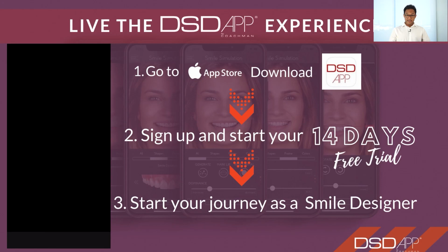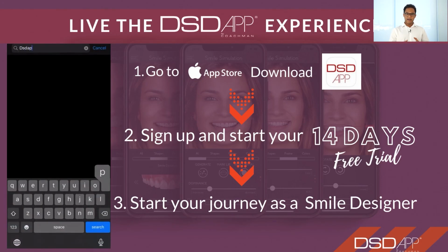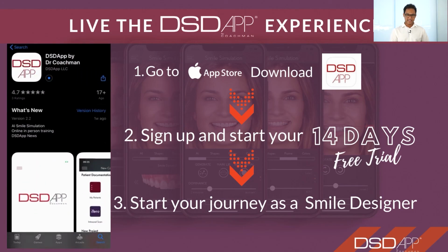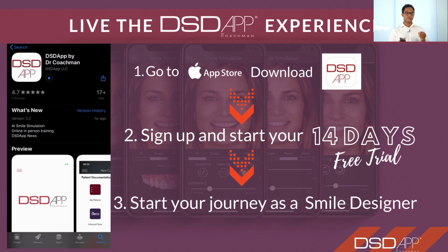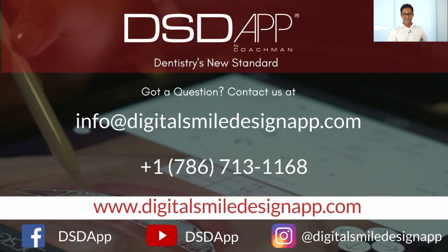So as you could see, DSDApp is a powerful tool to have in your practice. And I want to invite you, if you didn't do it yet, to download the app and start your 14 days free trial to start your journey as a digital smile designer.